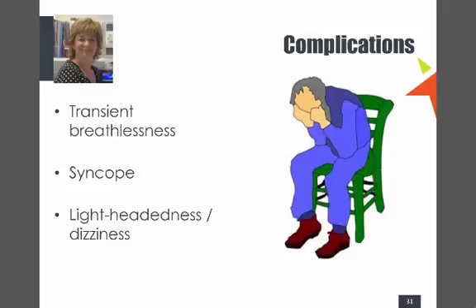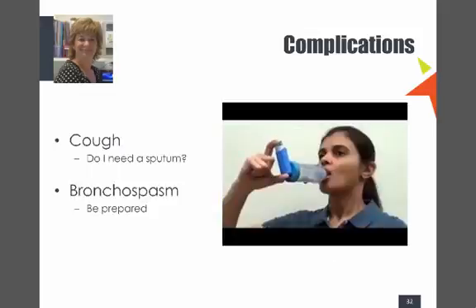Some of the complications, and that's why you want them sitting down, are breathlessness and syncope. I've not actually seen anyone faint, but I have seen people get very lightheaded and dizzy, like the guy who slid down the wall after telling me he really needed to stand up. I've never done it again. Coughing, often people will cough. If someone's been coughing up productive sputum for 2 or 3 weeks or over months, if they've got bronchiectasis, you might want to catch a sputum. Have a pot there. Don't waste the opportunity, because the next time you ask them for a sputum, they'll say, I'm not coughing enough. And bronchospasm, so be prepared for someone to have bronchospasm.